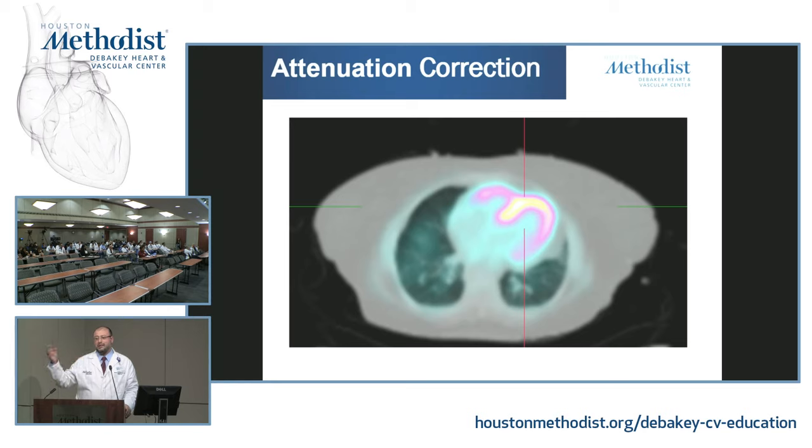However, there are many studies that have validated, from diagnostic and prognostic value, that you get a very accurate data set from 3D with the current electronics. Now, the newer system has been around only two years. We have few data, but we have done some phantom experiments. I have done one on our system to make sure our data is good, and we're getting a physicist at the end of the month to help build on this experiment, to make sure what we are getting appears reasonable, and that we're not saturating our crystals and others.